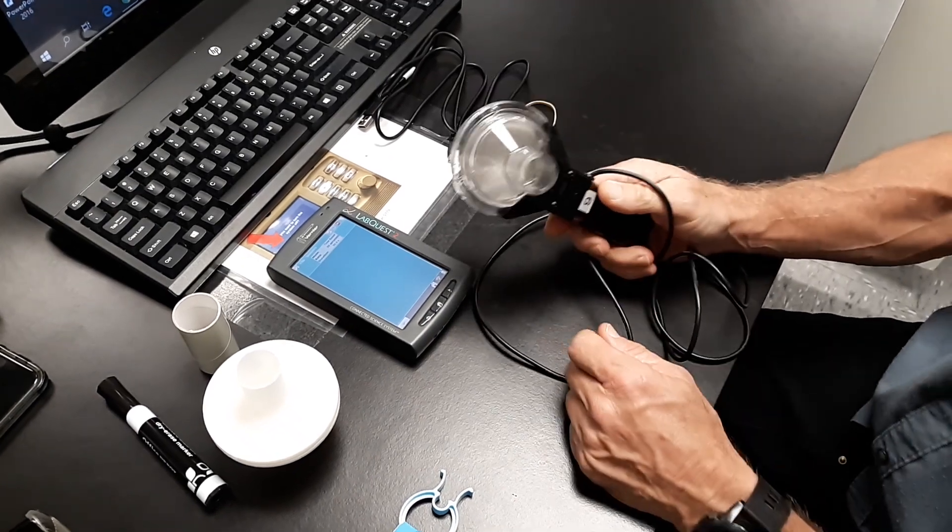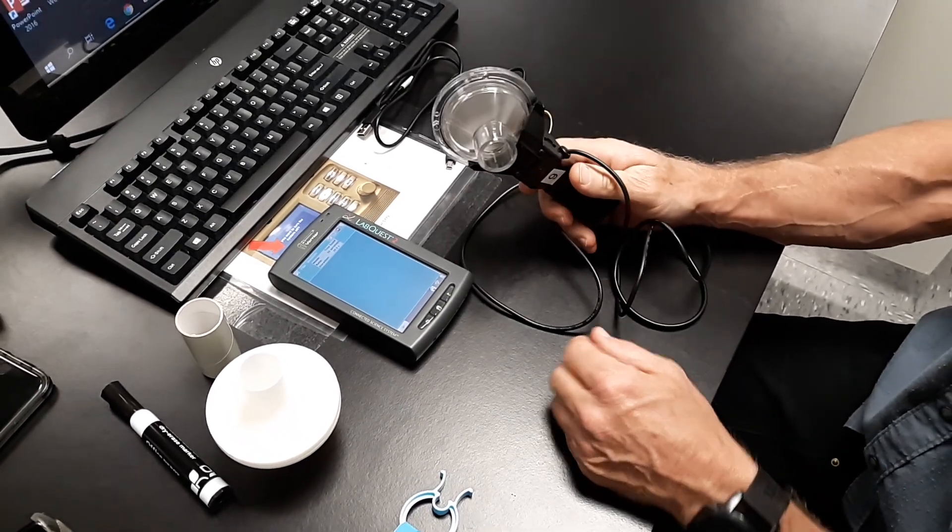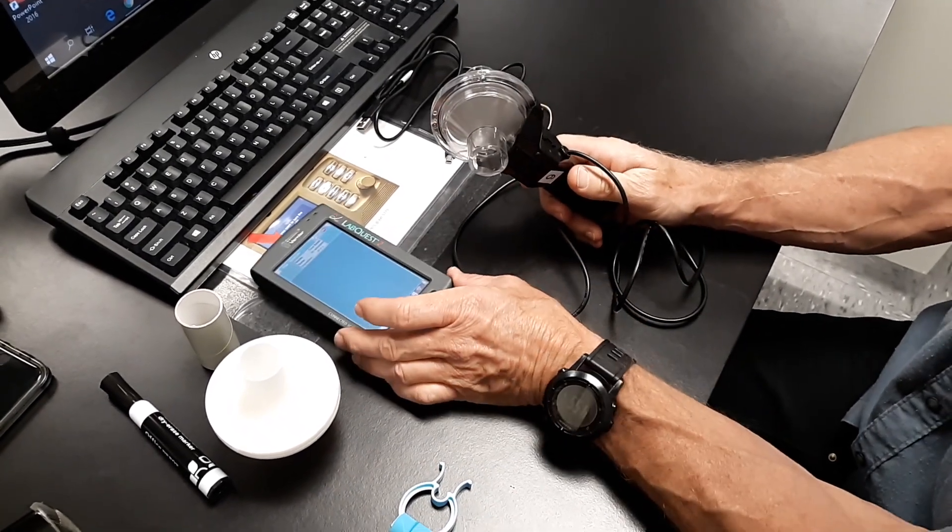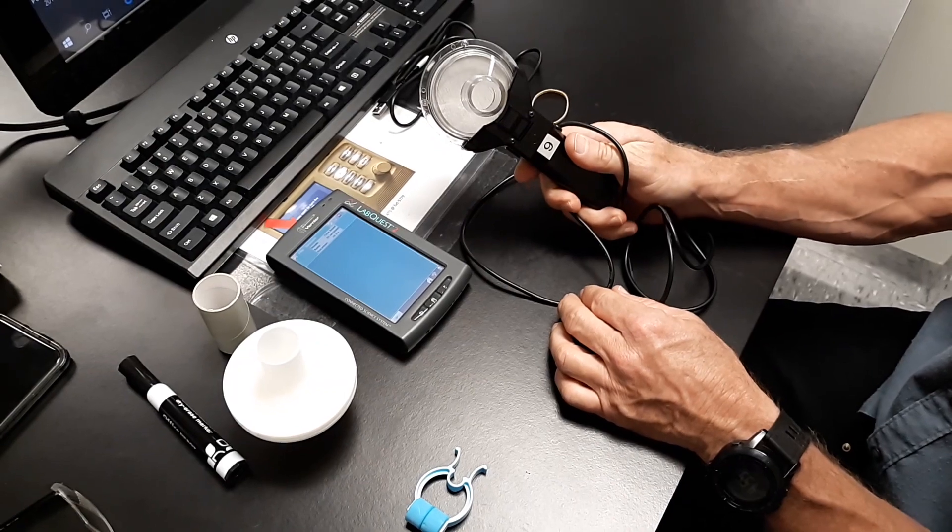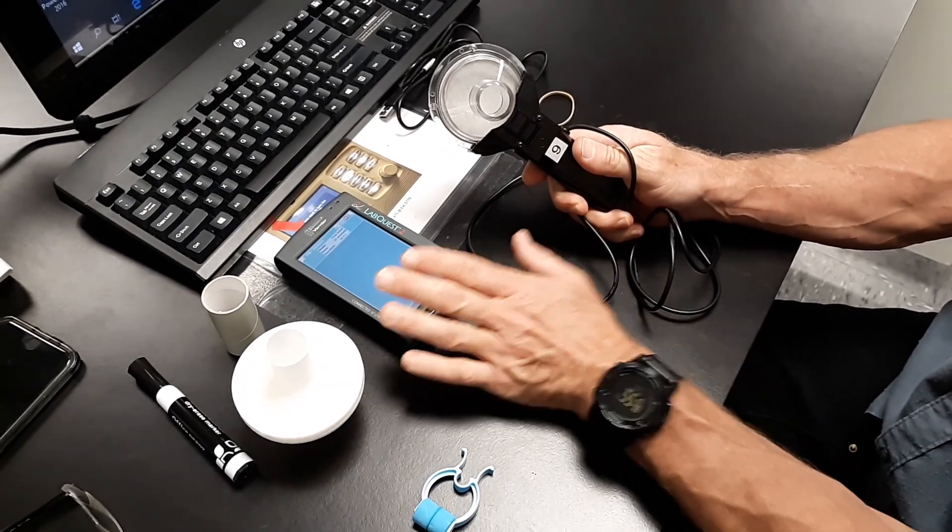All right everyone, I'm here to show you how to set up your spirometer.